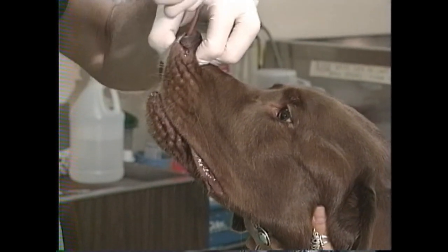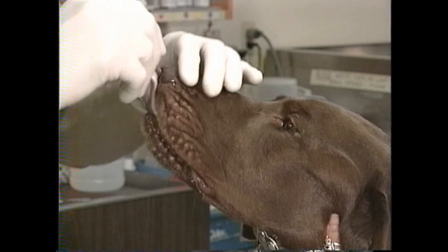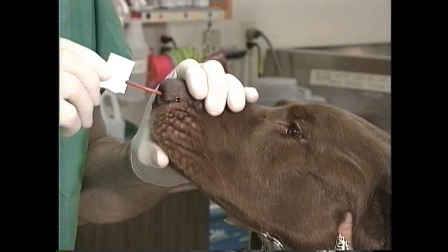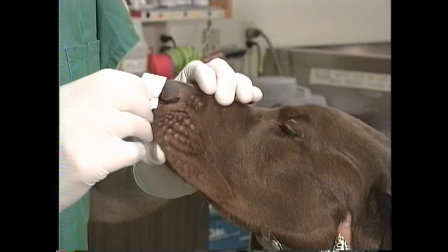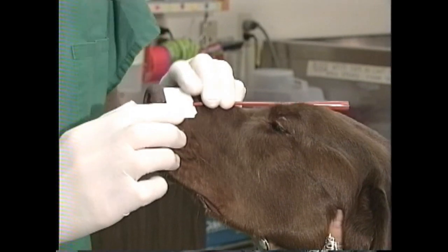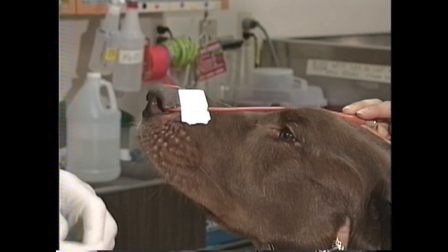We'll be a little more aggressive on this attempt, and once it's cleared the rostral end of the nasal bone I can stop with the mushing and pushing. This time it advances all the way to my marking tape and I know I'm in the correct location. I'm going to wrap that tightly around the wing of the ala and plan the suture location.